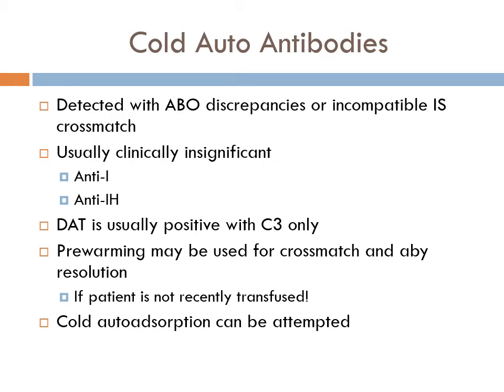How pre-warming is done depends on the facility where you're going. In my facility, we don't do pre-warming at all. What we will do is cold auto adsorptions, especially if the patient has not been recently transfused, just to try to pull out those cold autoantibodies. Just like we did with the warm autoantibodies, you think about where that antibody is reacting. If we're talking about a warm autoantibody, we're going to try to incubate those red cells at 37 degrees to pull out the warm. And then with cold autoantibodies, we're going to try to incubate those cells at 4 degrees to pull out these cold autos.